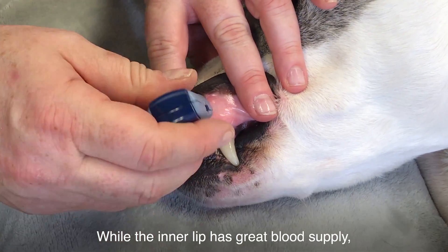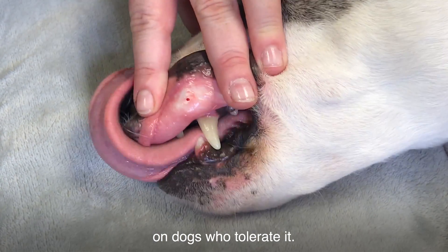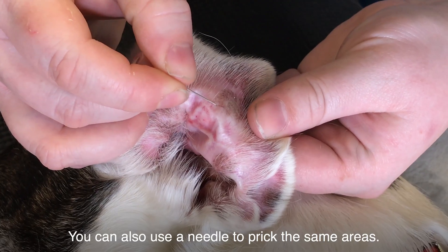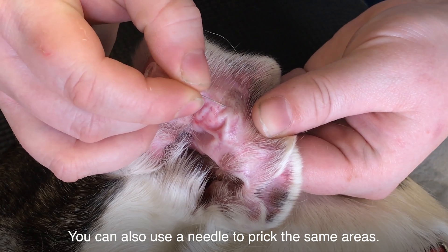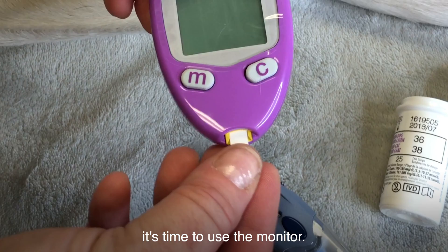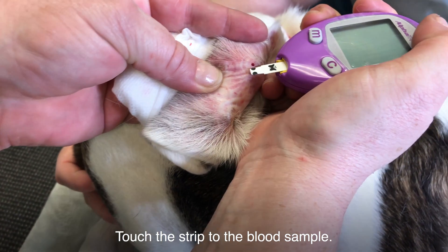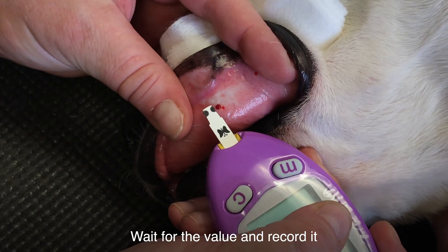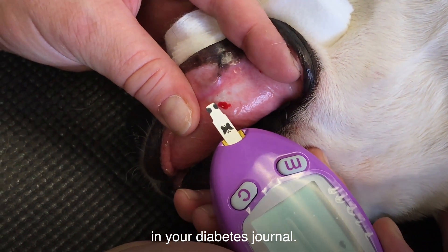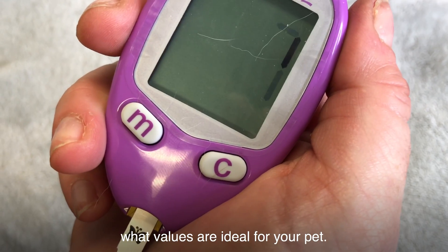While the inner lip has great blood supply, it's important to only perform this on dogs who tolerate it. You can also use a needle to prick the same areas. Now that you have a blood sample, it's time to use the monitor. Insert the strip into the glucometer, touch the strip to the blood sample, wait for the value, and record it in your diabetes journal. Your veterinarian will help you determine what values are ideal for your pet.